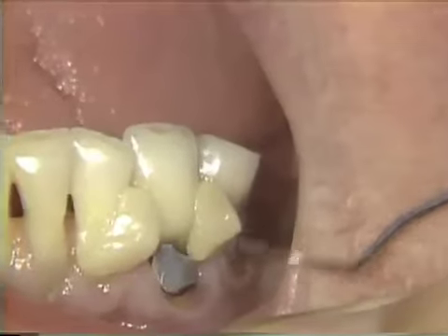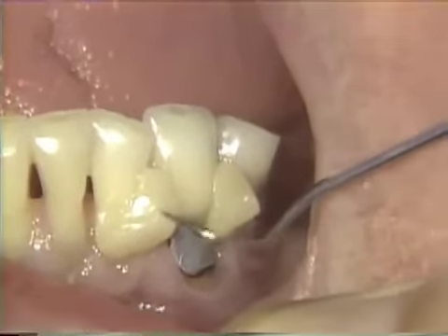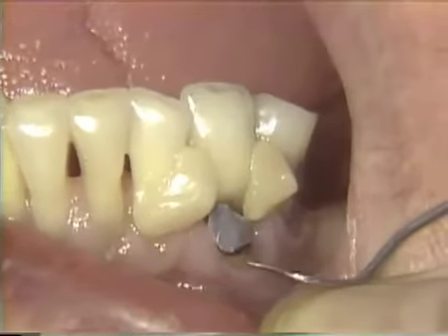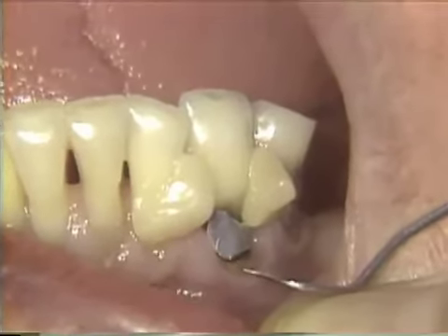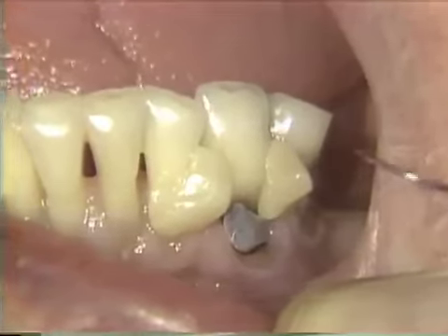However, dark gray is closest to the natural tooth color at the incisal, while dark yellow is closest at the cervical. These two color composites will be layered and contoured to more closely match the natural tooth color variation. For a better understanding of this concept, this illustration will be used to demonstrate the procedure to follow.